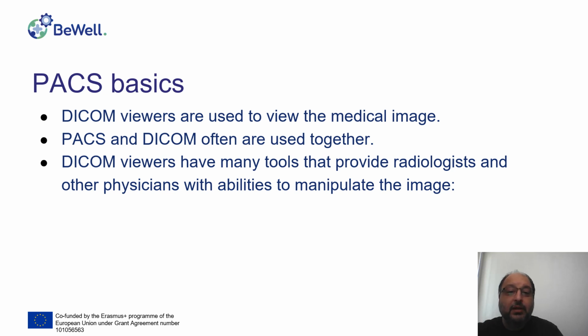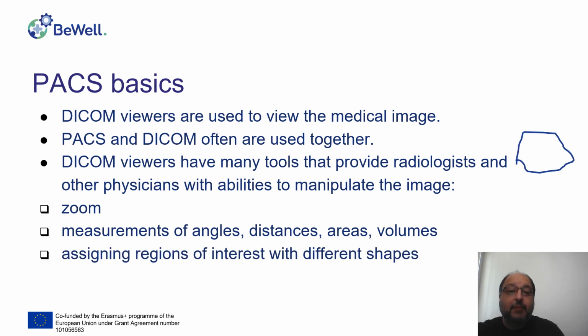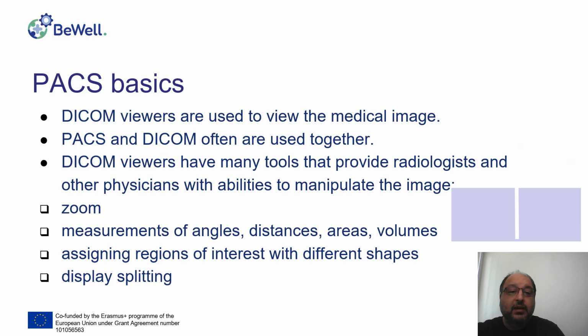For example, one may use zoom in order to enlarge the image. One may use measurements of angles, distances, areas, volumes, for example, and assign some regions of interest with various shapes, split the display in order to look at two different images at the same time, for example, and also there is the ability for 3D reconstruction.